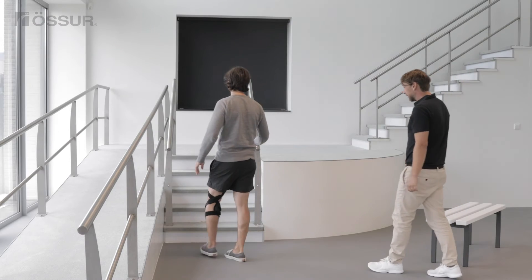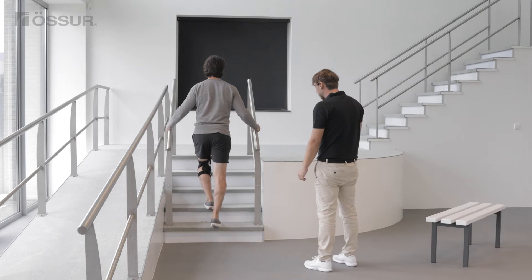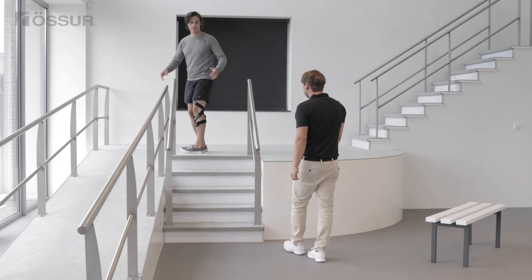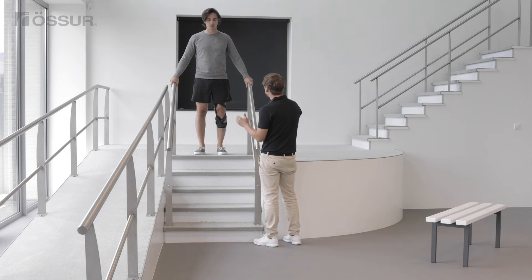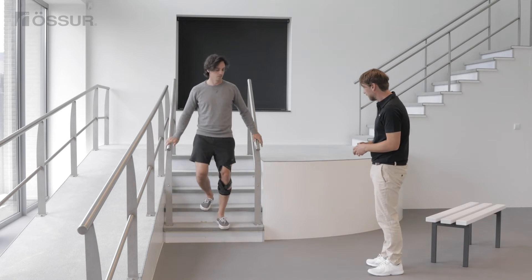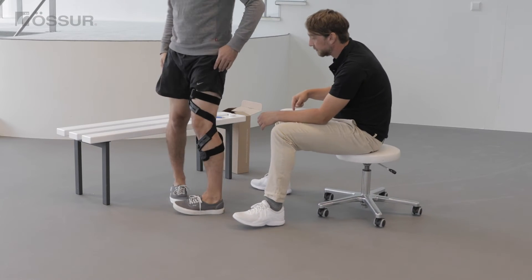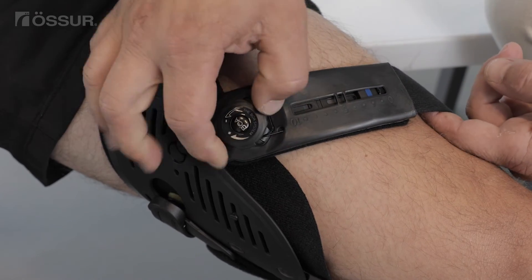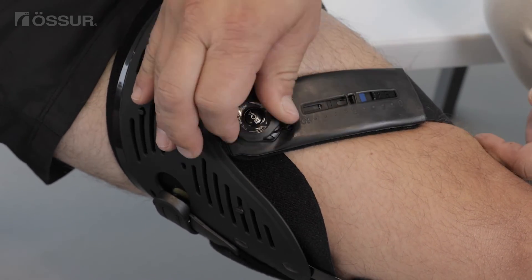Ask the user to take a few steps, also on stairs or a slope if possible, to see how the brace fit feels. Verify brace positioning and the optimal cartilage protection strap tension based on the user's feedback. Aim for a final smart dosing setting at the middle position.